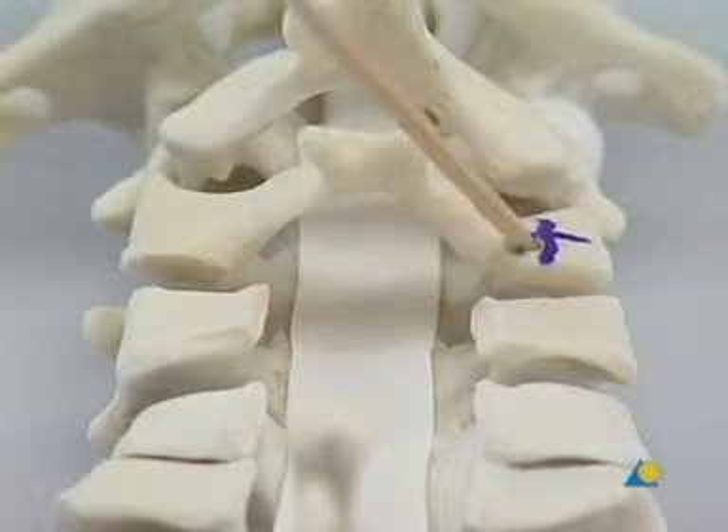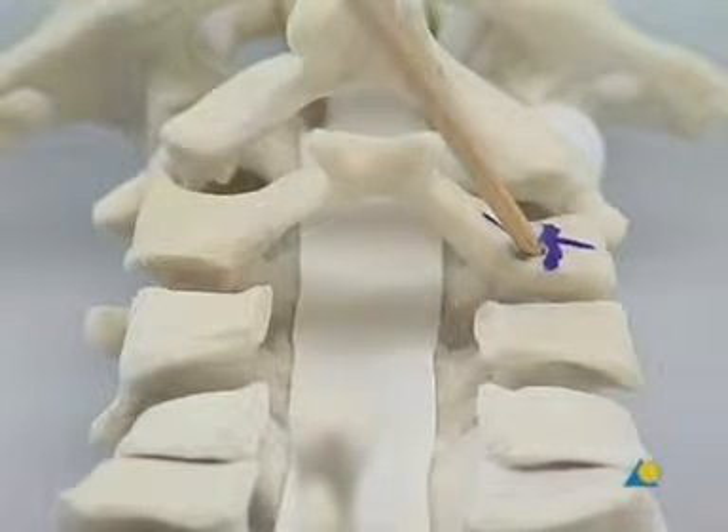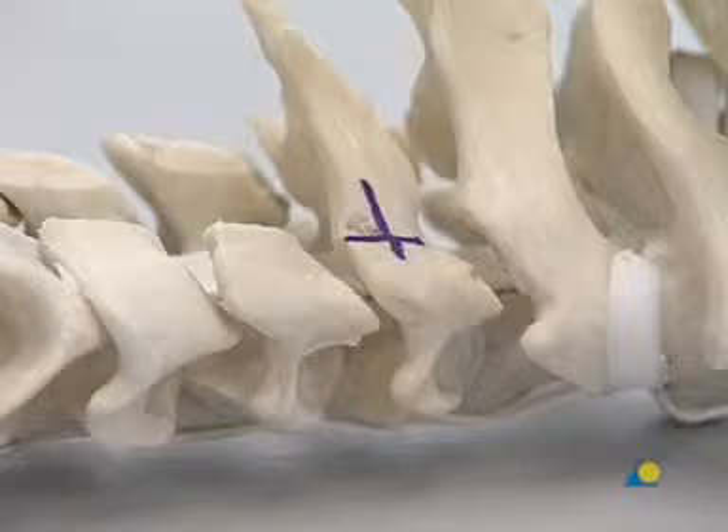The screw has to diverge at least 25 degrees laterally so that the screw tip will be located far away from the vertebral artery and the nerve root. At the same time, the cranial angle must not exceed 30 degrees. Anything more would impede rod insertion.